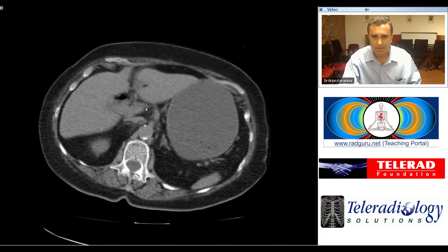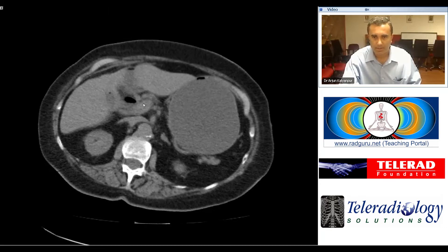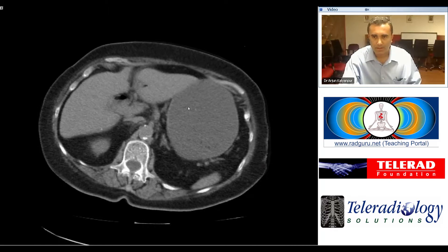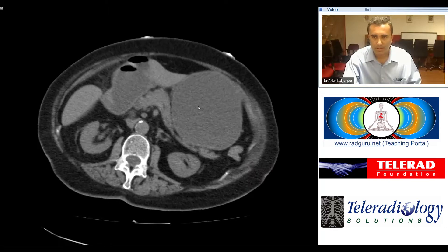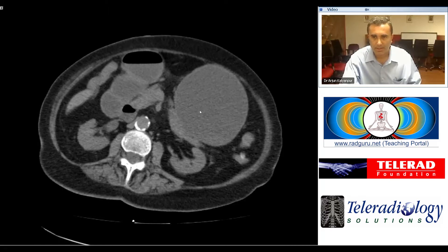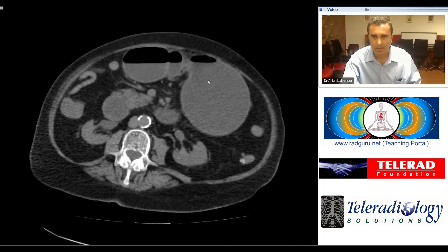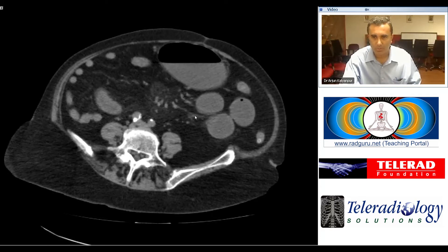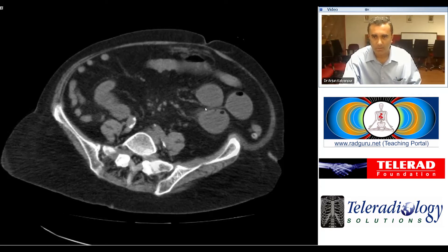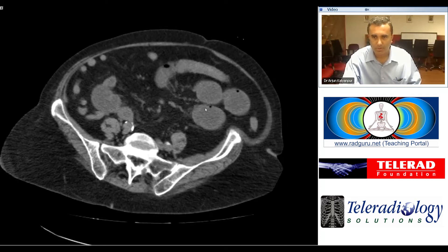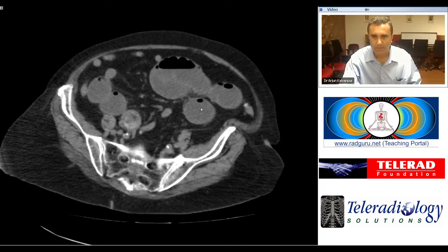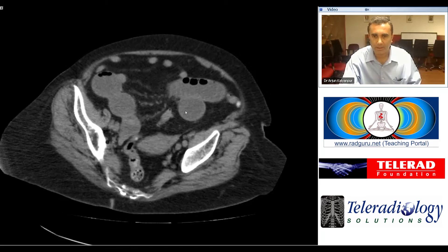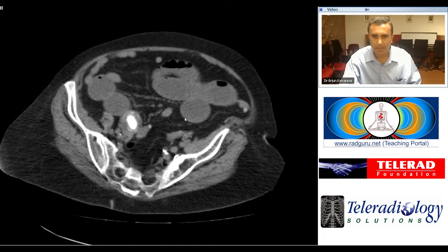This is centered around the porta hepatis. We also see that the stomach is significantly distended with a large fluid level. There are some distended small bowel loops here which also demonstrate air-fluid levels.